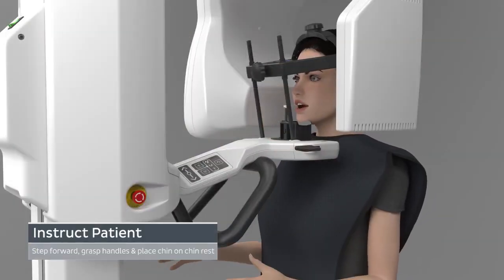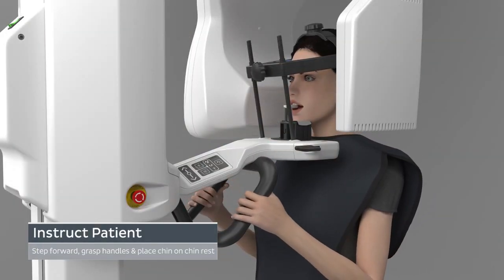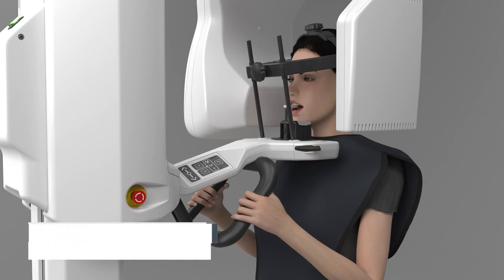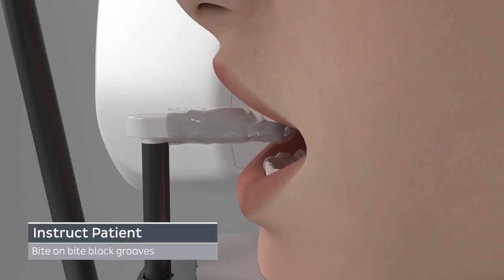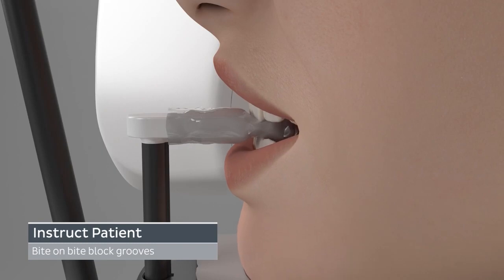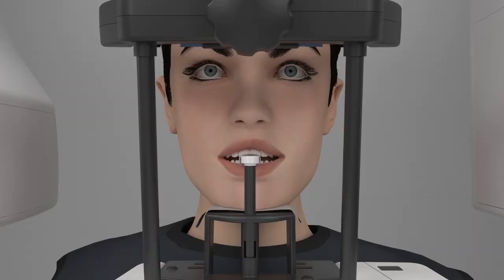Have the patient step forward, asking them to grasp the patient handles and place their chin onto the chin rest, and bite on the bite block so that both the upper and lower anterior teeth are in the bite block's grooves.